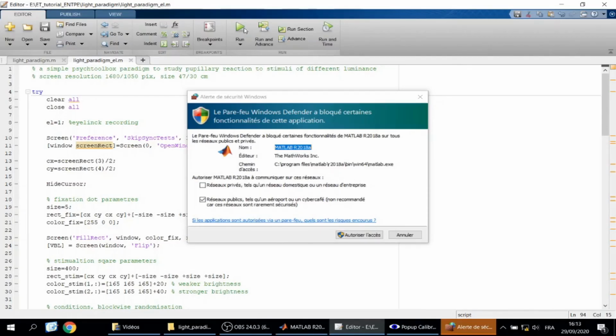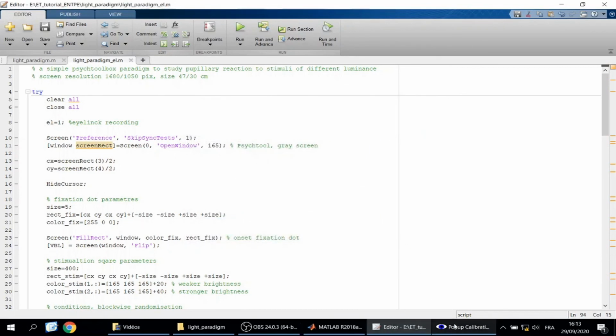And the signal must be pretty powerful, despite the fact that I was distracted during the procedure.